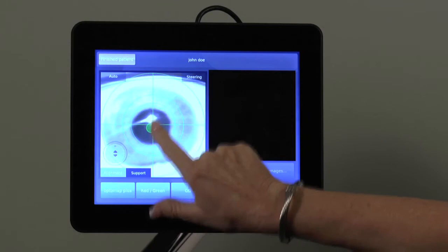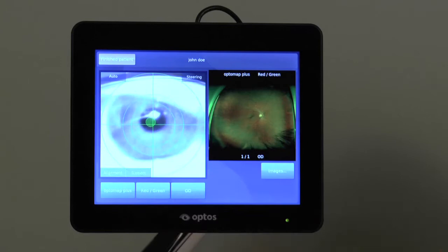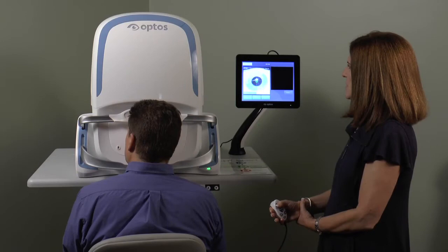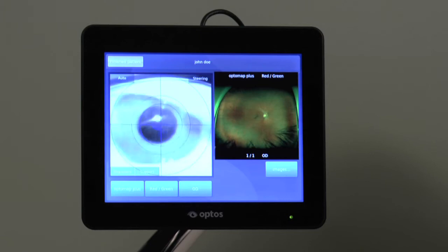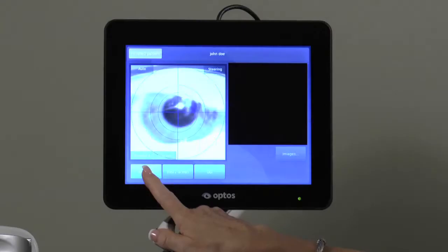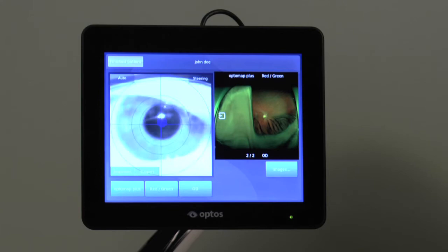You may capture an image by tapping the center of the screen when the patient's eye is optimally aligned. To capture an image using the hand controller, simply depress and release the button at the top. It is helpful to advise the patient when you are about to image to avoid capturing a blink. Instruct the patient to open both eyes very wide and to not move or blink in order to minimize the presence of lids and lashes in the image.